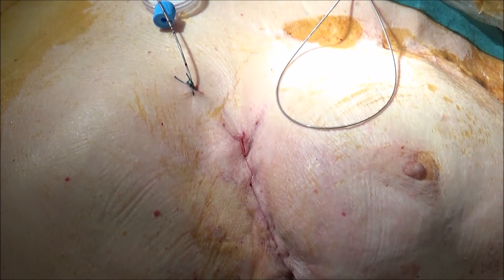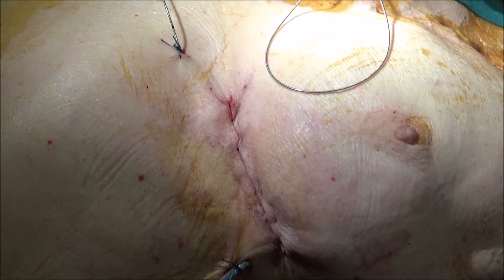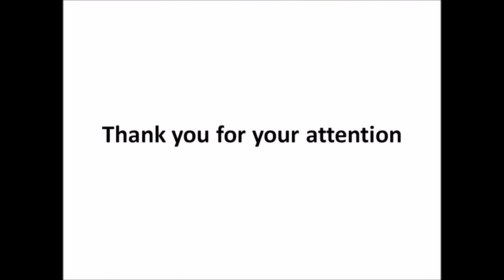Surgical closure was done as usual. Thank you for your attention.